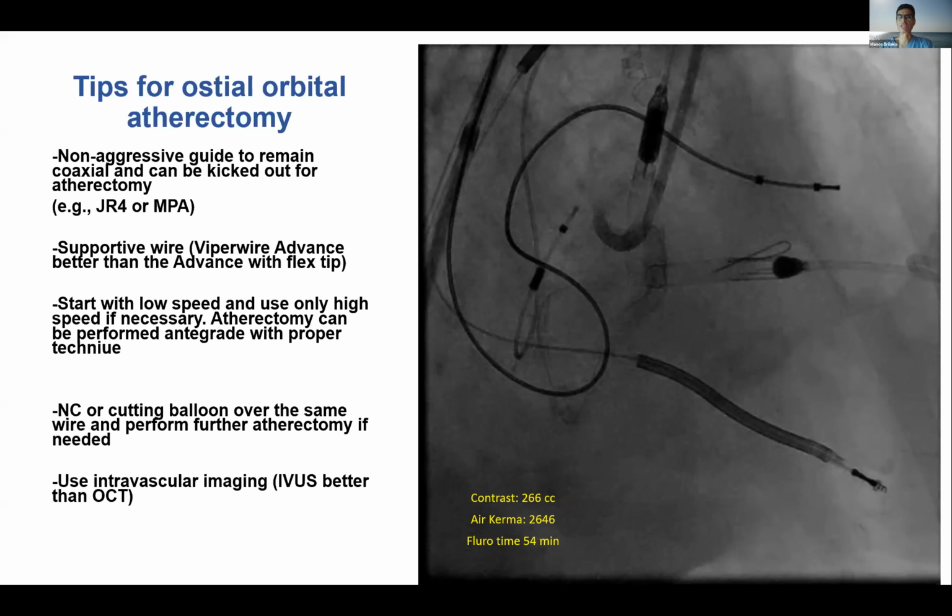It is obviously an expensive proposition to do it. It does work for many lesions. The key there is whether you have circumferential calcium or not, I think, in my mind. If you don't have circumferential calcium, IVL might not work quite as well as if you have a circumferential calcium ring, because there's an area where the waves get diffused and they don't hit the plaque hard. At least we've had a few cases like this where it was harder to expand.